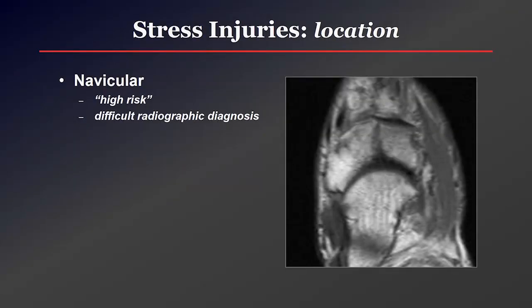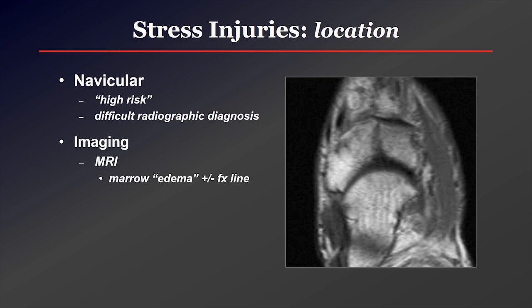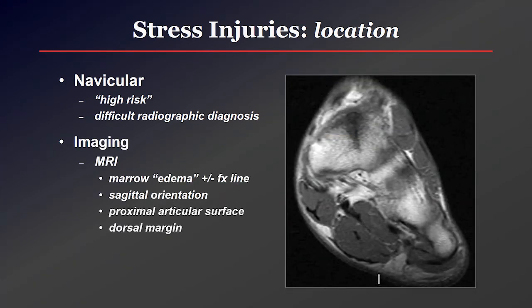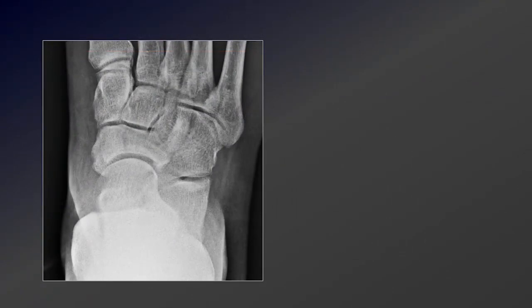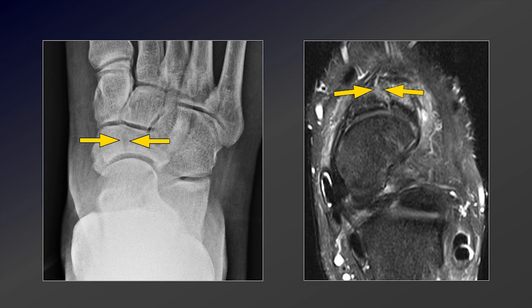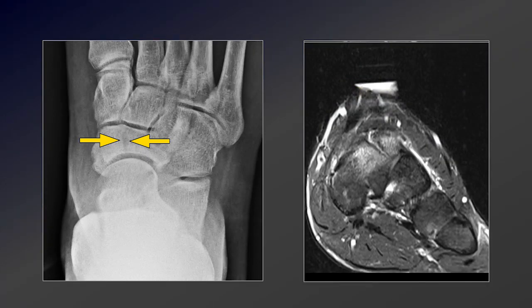The navicular is one of the high-risk stress fractures — a very difficult radiographic diagnosis. On MR we may see primarily edema with or without a fracture line. These fractures tend to occur in the center of the navicular in a sagittal orientation, usually beginning along the dorsum of the bone at its proximal articular surface and propagating sagittally. On a radiograph there's a lot of overlap in the midfoot, but there is a central navicular sagittally oriented lucency. If you see just bone marrow edema, CT can help identify a fracture line.